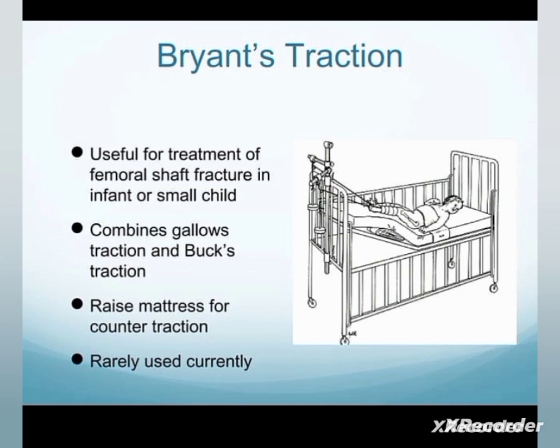This is another picture of Bryant's traction. It is useful for the treatment of femoral shaft fracture, especially in kids. This traction is rarely used nowadays, and it can be used with Buck's extension traction.